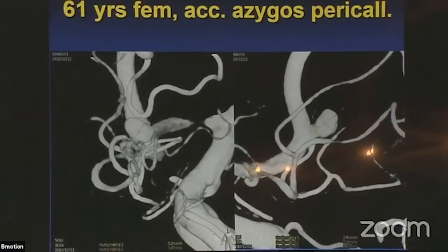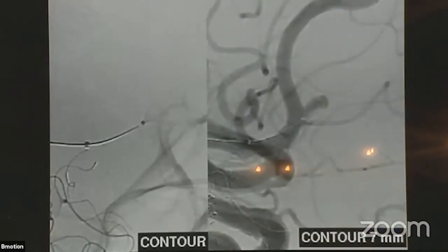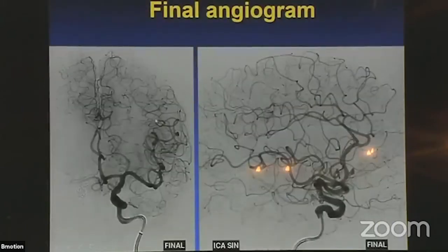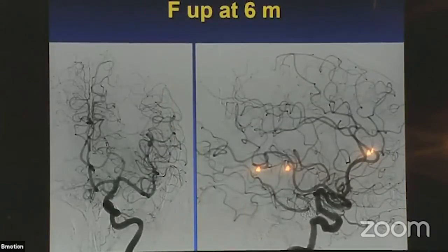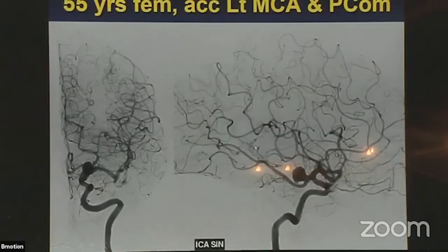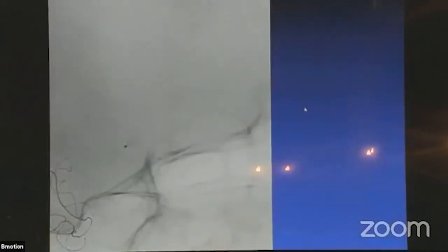This was a smaller pericalosal aneurysm — easy catheter access. I want to show how important it is where you place the device. It was a 7 mm device with very good stagnation in the sac. The final and follow-up angiograms look good, but not perfect — there is still some inflow into the aneurysm. Why? Because I should have pulled the device back a little. The device should have been at the neck, not just the marker. I needed to pull the device further out of the parent artery to occlude the whole aneurysm. This is the learning curve.